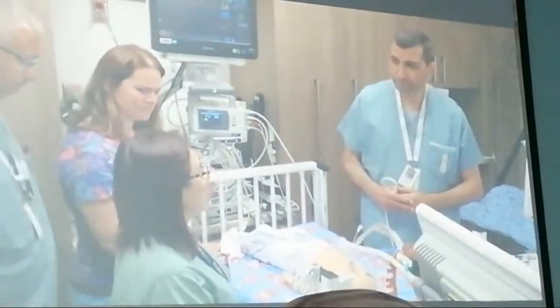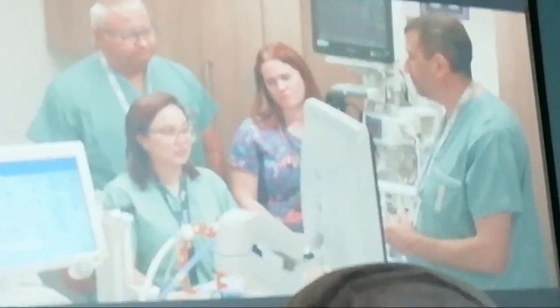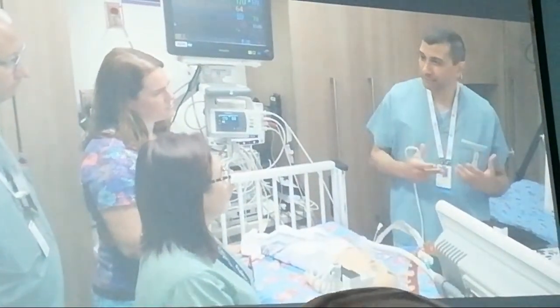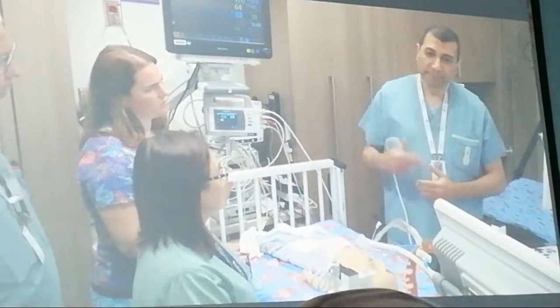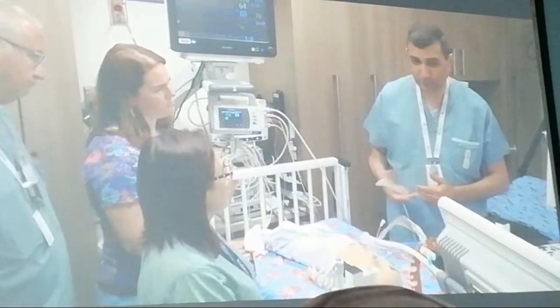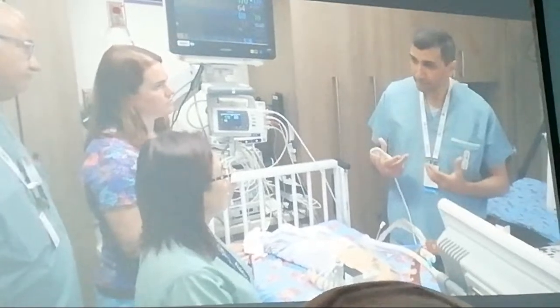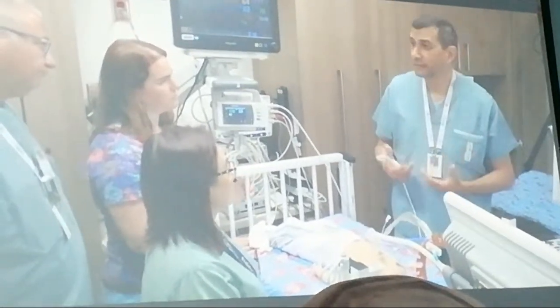So, Yasser, what's the mechanism of hypoxemia that's happening in this? Yeah, that's a very good question. So we already ruled out pulmonary hypertension and a patent ductus arteriosus. The mechanism which makes sense, also with the oxygen reduction test that we did before, is lung atelectasis, under-inflation of the lung, and also significant intrapulmonary shunt.